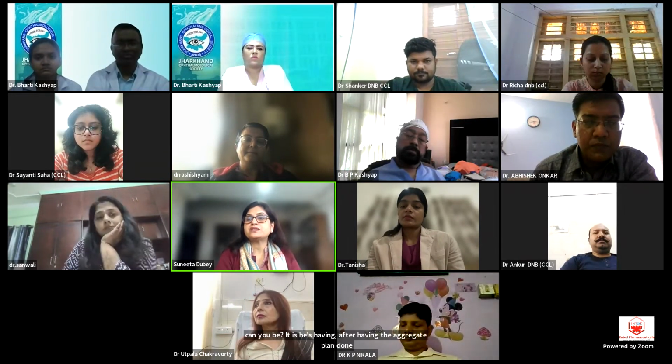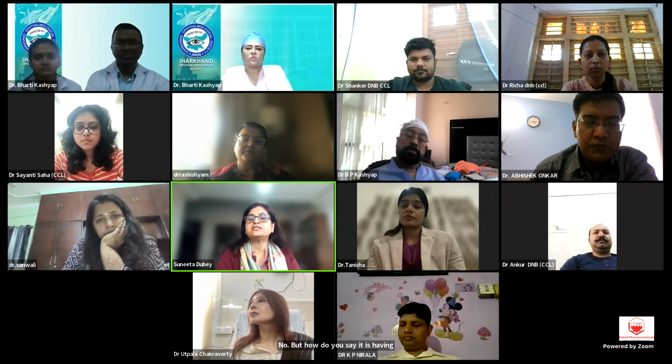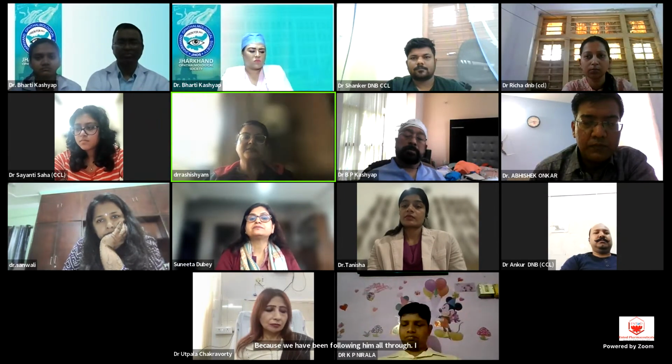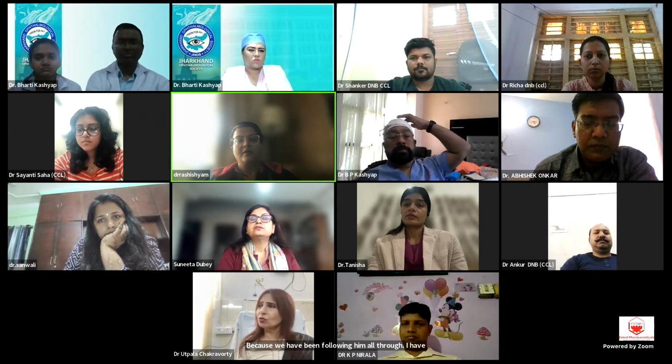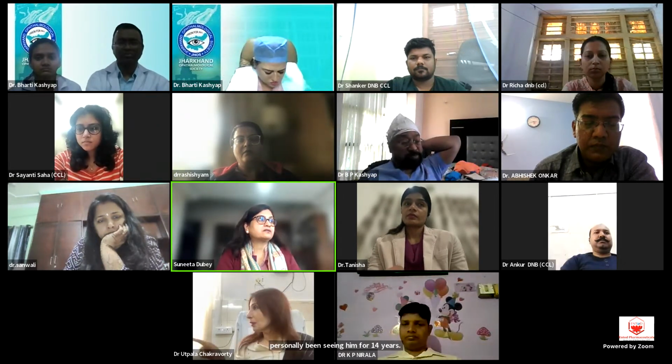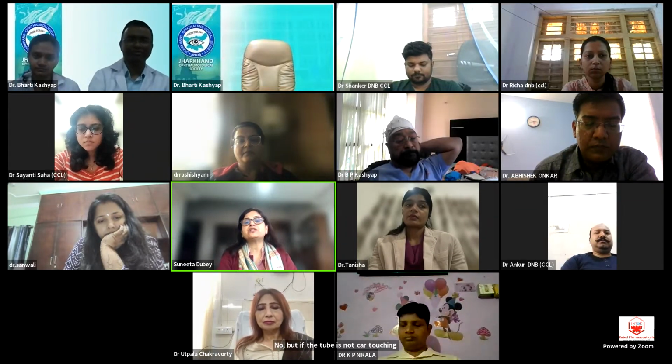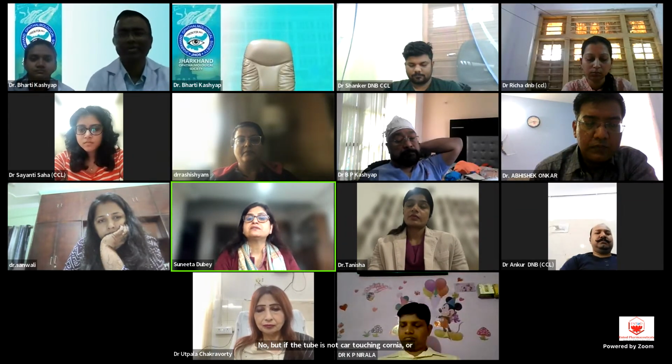So he has recurrent uveitis after having the AGV implant done. But how do you say it is after the AGV? Because we have been following him all through. I have personally been seeing him for 14 years. If the tube is not touching the cornea or iris, and if the pressure is well controlled, then you can just treat the uveitis.